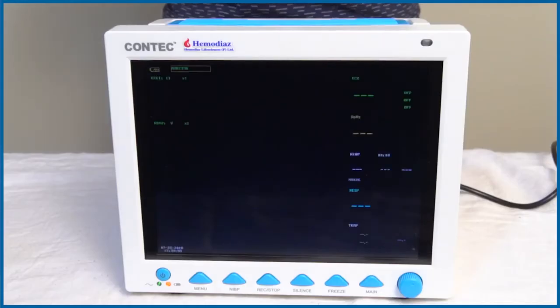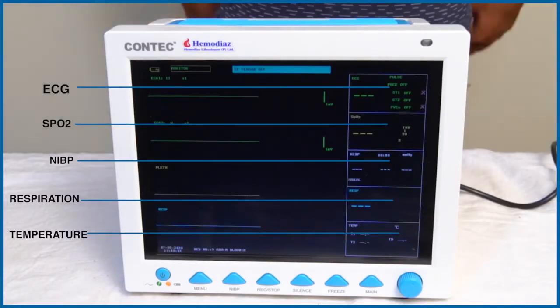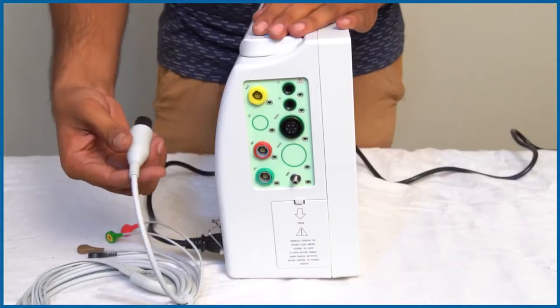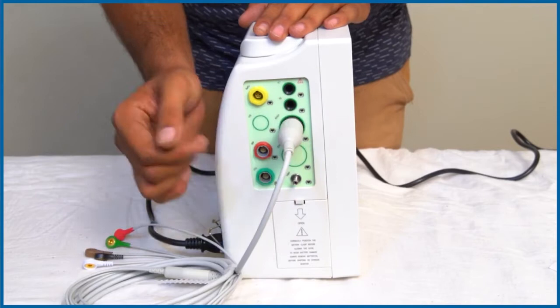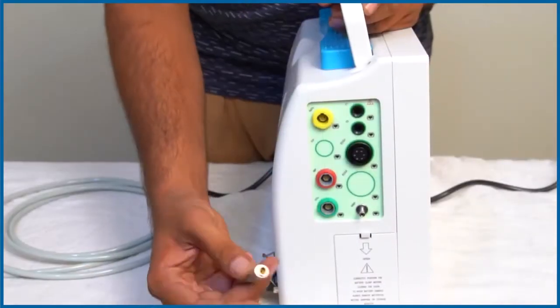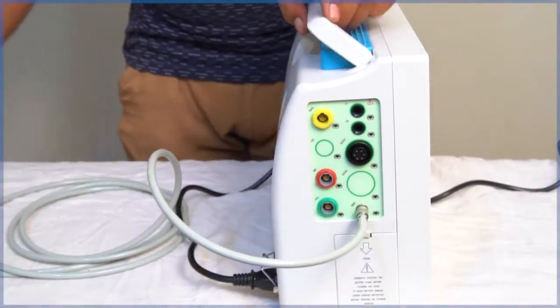Here you see the different parameters: ECG, SpO2, NIBP, Respiration, and Temperature. Now let us learn how to connect the ECG cables — these are to be inserted in the port as shown in the video. Next, connect the extension cable to the port and then place the BP cuff as shown in the video.